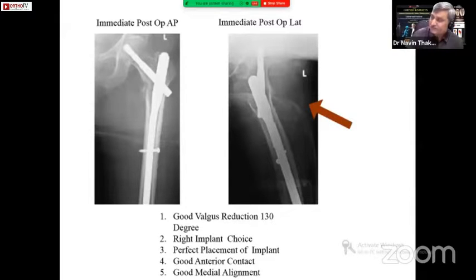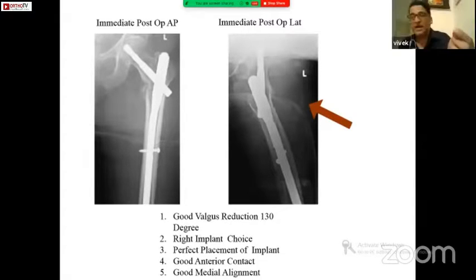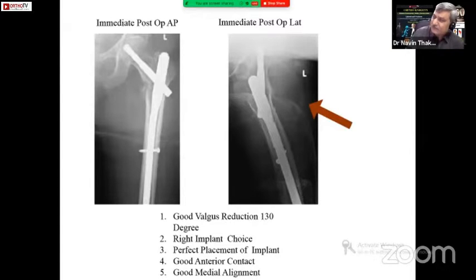Yes, it prevents, because the tip apex distance is just barely about 5 millimeters. So that hold was not there. And the moment the varus happened, the screw penetrated into the joint. It is a good TAD, less than 25 TAD.